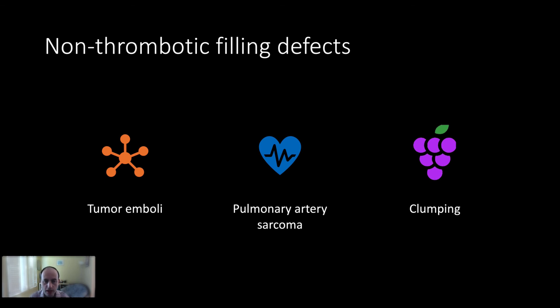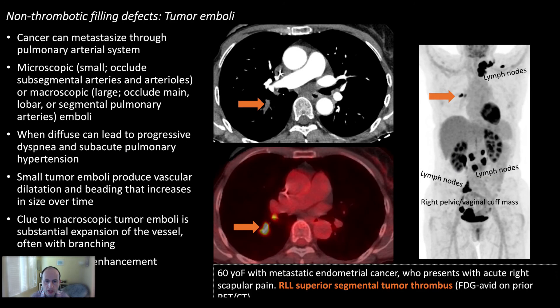Moving on to non-thrombotic filling defects: tumor emboli. This looks like a PE but instead of thrombus it is actual tumor embolizing into the pulmonary artery, as seen in this patient with endometrial cancer — it is FDG-avid on PET-CT. In tumor thrombus the vessel tends to be quite expanded, much more so than in acute PE. In acute PE, vessel enlargement is described but is typically very mild. If you see true marked enlargement of a pulmonary artery with a filling defect, question whether it could be a tumor embolus.